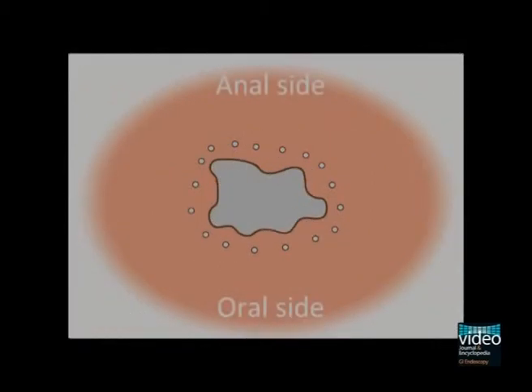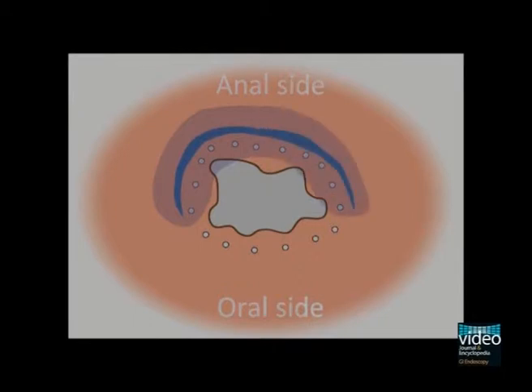In esophageal ESD, we principally start procedures from its anal side. Injection and incision are sequentially made for each quarter of the circumference.